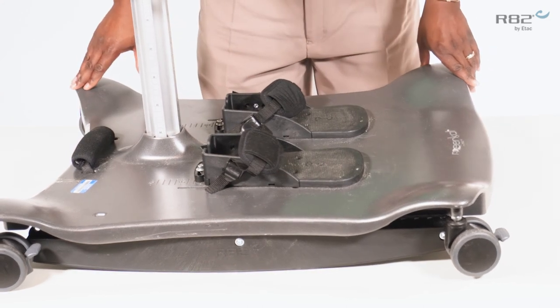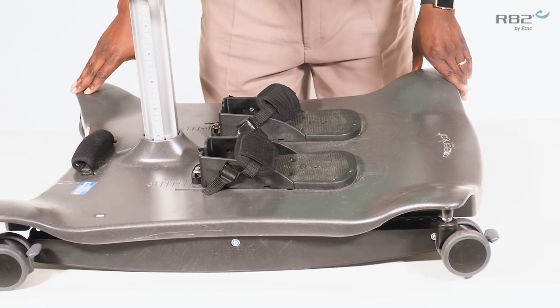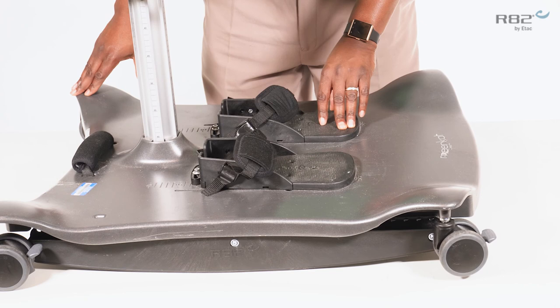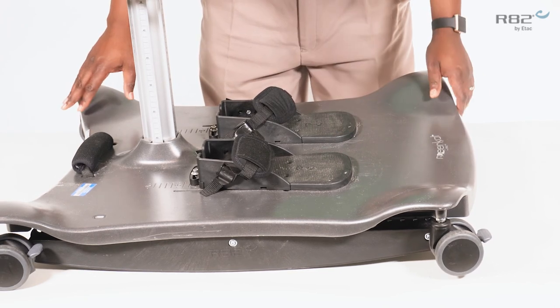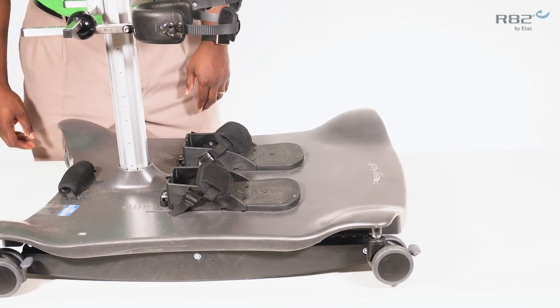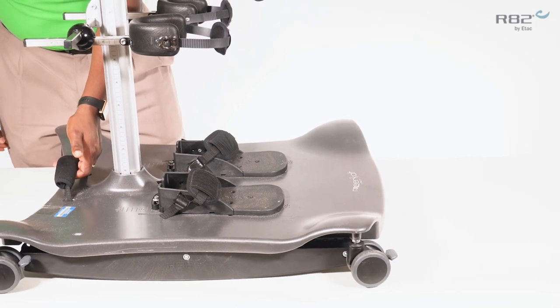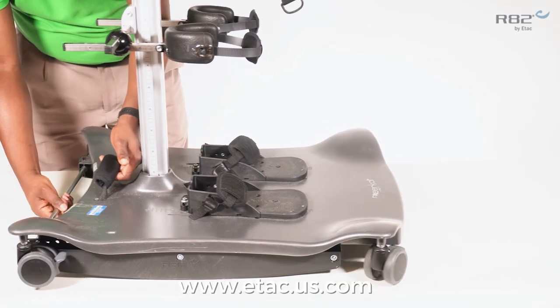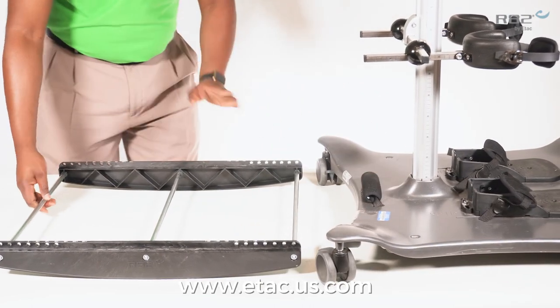It is extremely important to remember that best practice is to remove the rocker prior to transferring the user, so that you are able to lock your swivel casters. To remove the rocker from the base of the Meerkat, pull the handle and push the Meerkat forward off the rocker.